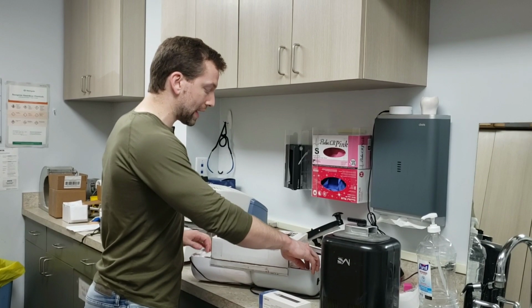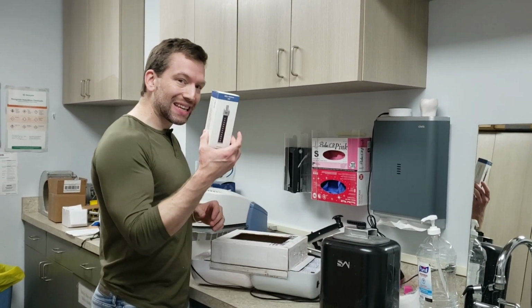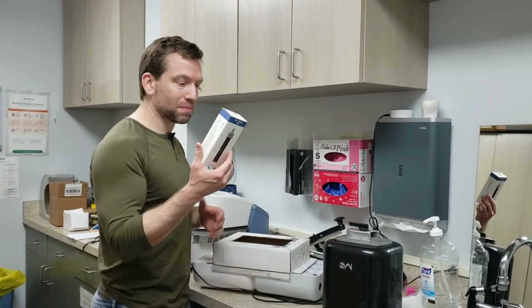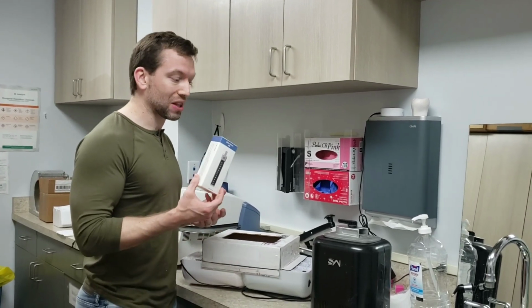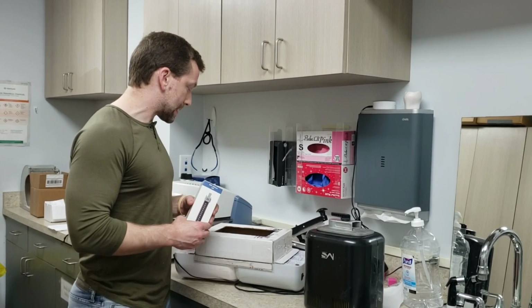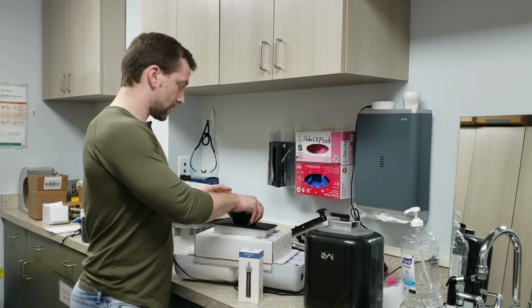So anyway, two lights, a box, get these. They're like $25 for a set of them, maybe $30. It's really not that expensive. I know it's as expensive as a light, but they should last you almost forever. So I think that's it.